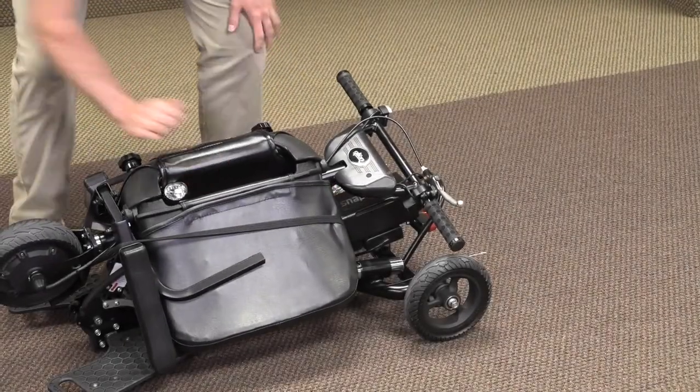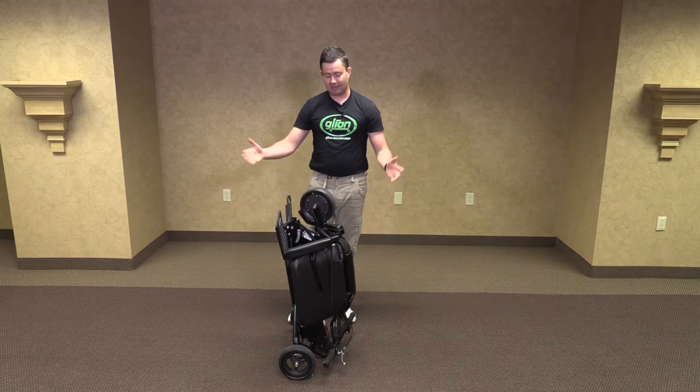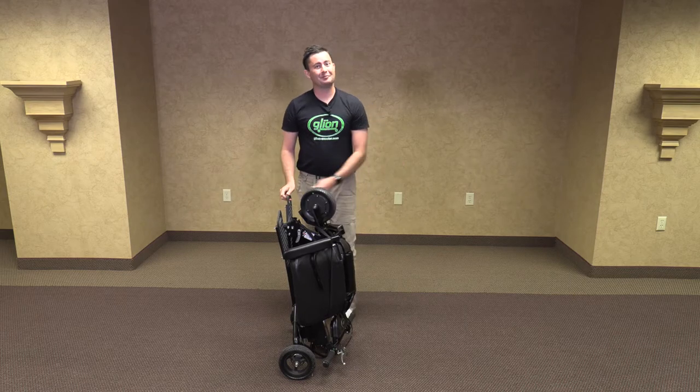Once it is latched, you can stand it up and you are ready to go. This model does have a self-standing option where once you get it upright, it stands on its own.